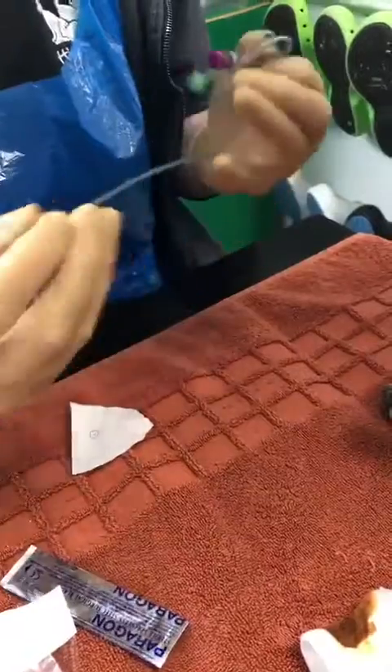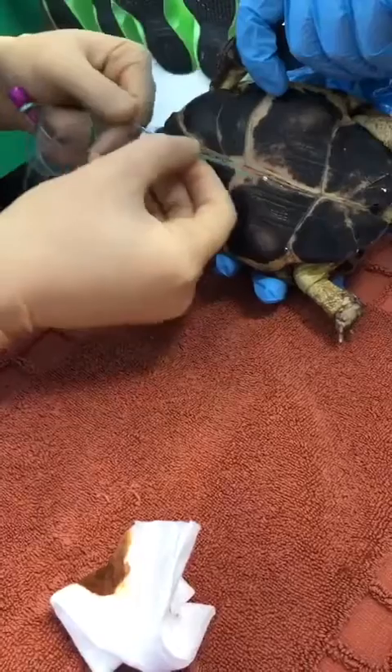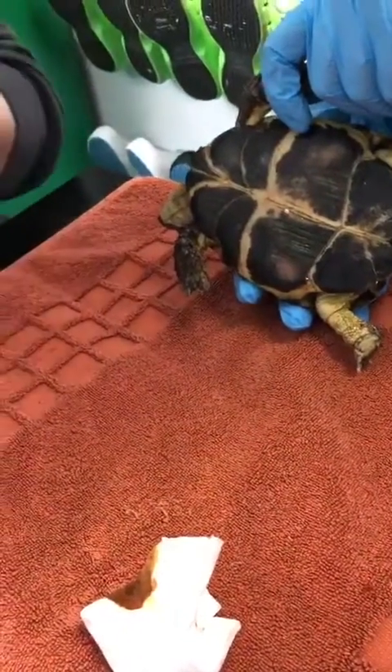We want to measure the tube from the middle of their plastron to the point of their neck. We're going to want to have it at about 7 on this tube.